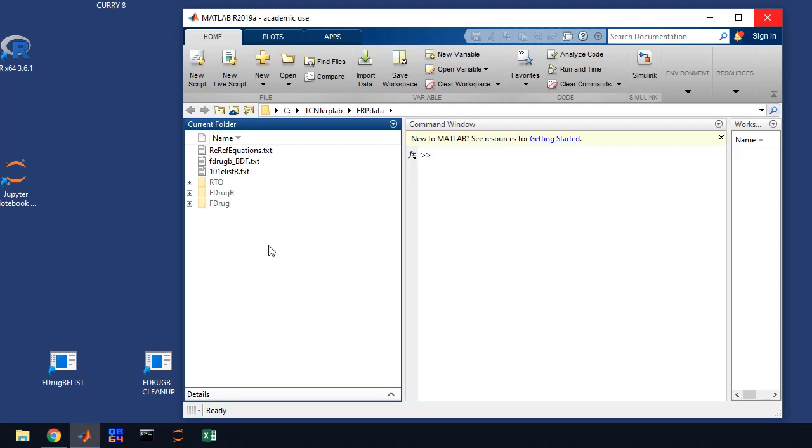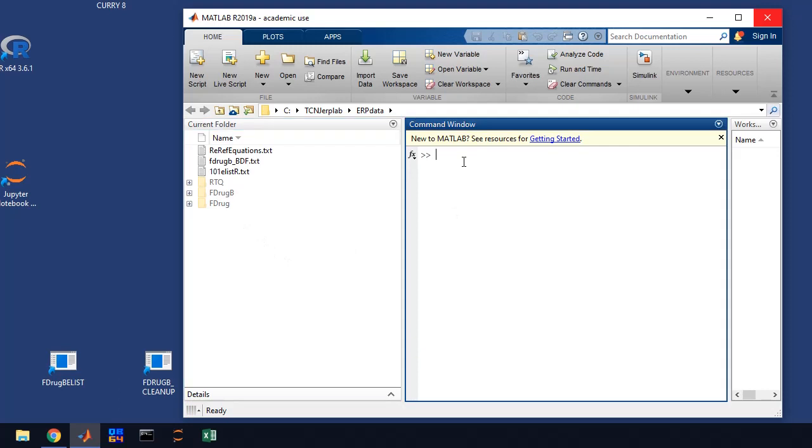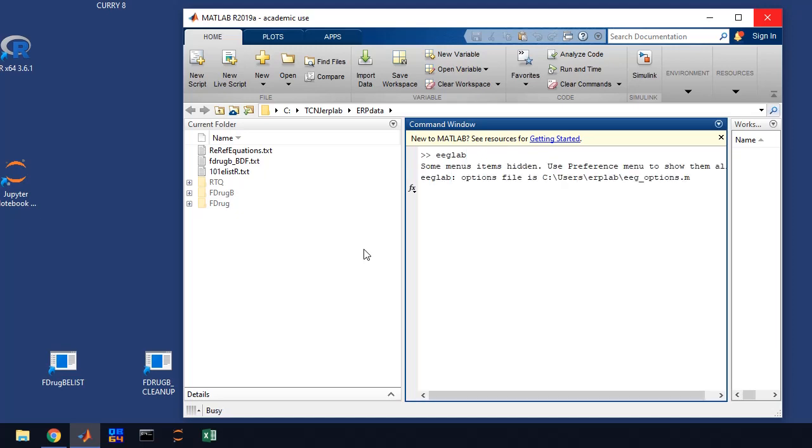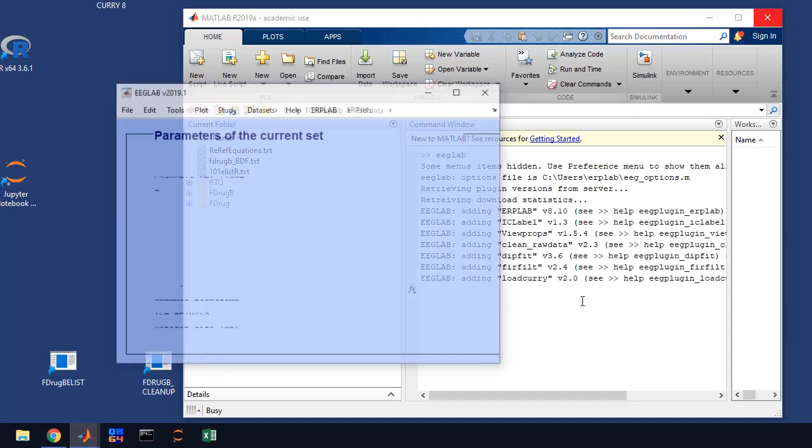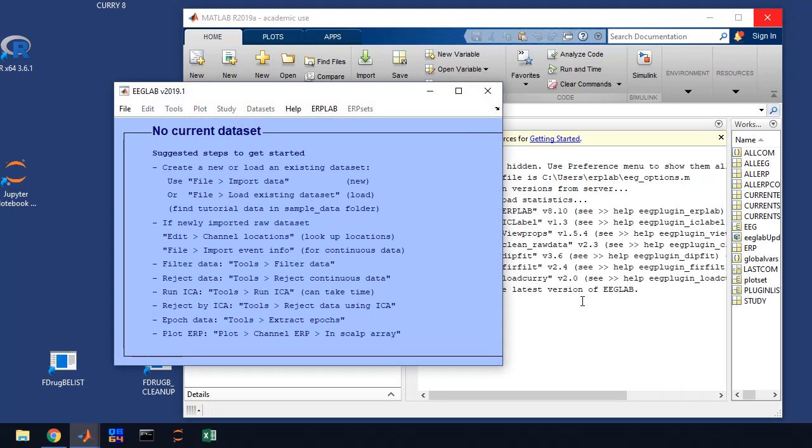The next step you're going to start EEG lab. You just type EEG lab at the MATLAB command window, lowercase, press enter, and EEG lab is going to start. You'll see some messages come up here and EEG lab is this bluish purple window here.